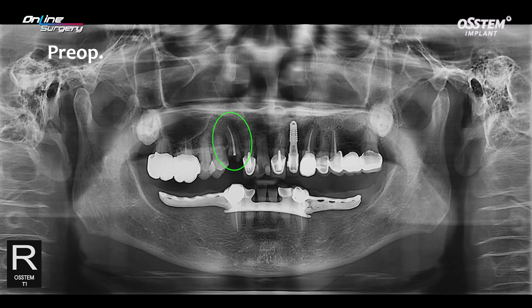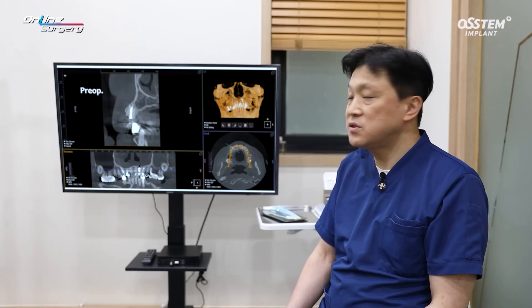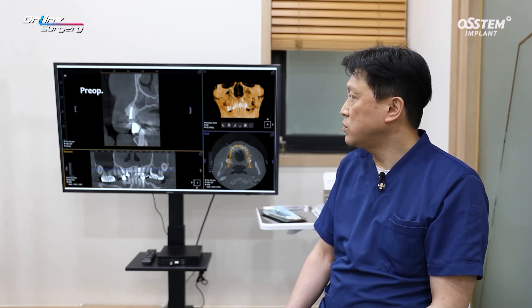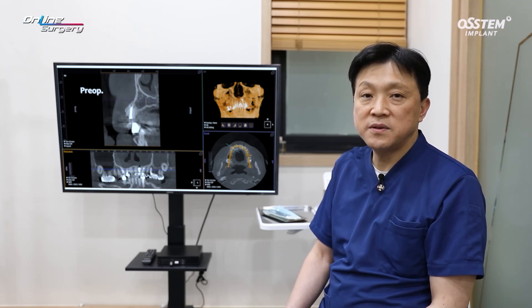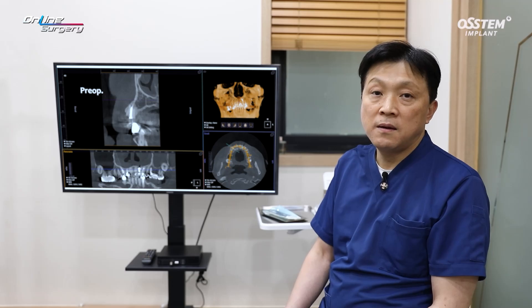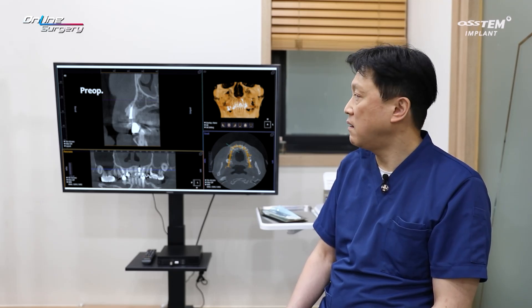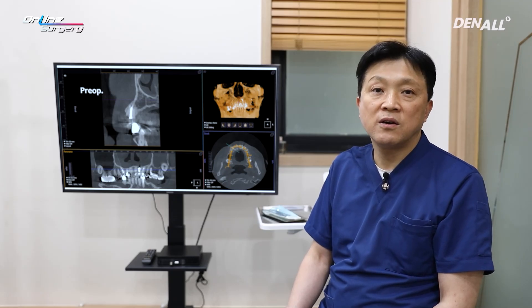This is the panoramic image pre-op. There is a fracture in number 13. On CT, the root projection angle is very vertical. A common error is placing the implant in the direction of the root, which can result in a fenestration defect towards the apex side — there is a high possibility of that.